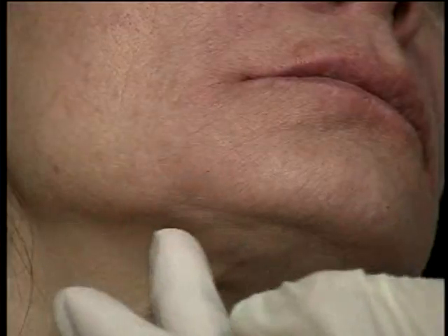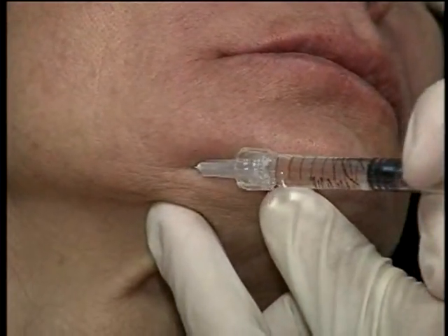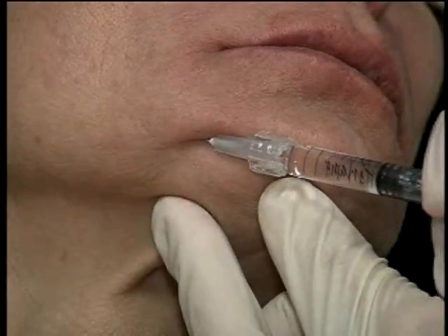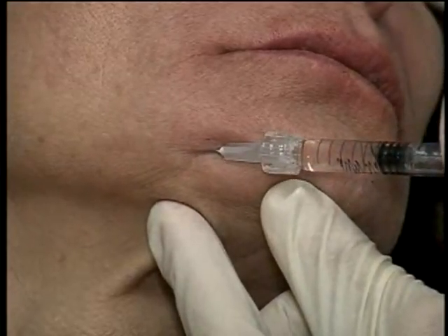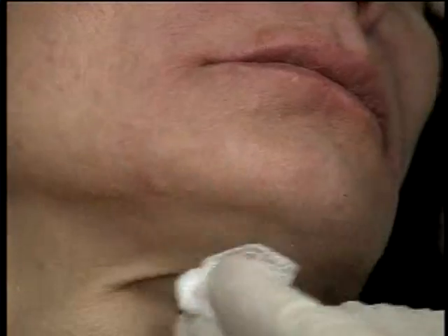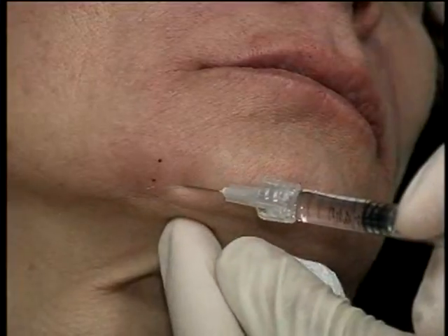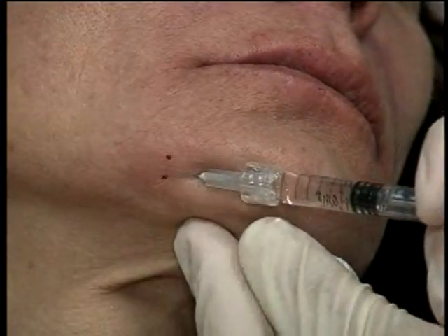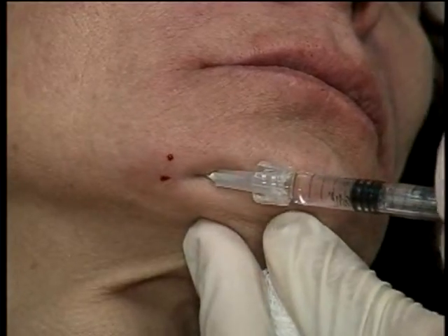And I still see a little depression in this area, so I'm going to put a little bit more in there. I come a little bit around the inner surface of the mandible. Just injecting in a fanning method. Now I'm deep here. That's one of the things I like about this product, the deeper version of the product, is that I can volumize the face. So I'm not in the dermis, although many may recommend being in the dermis. I like to be below the dermis here. And we'll fill in a little bit more right here. And it often takes a little more product to do this, but the results are quite worth it.